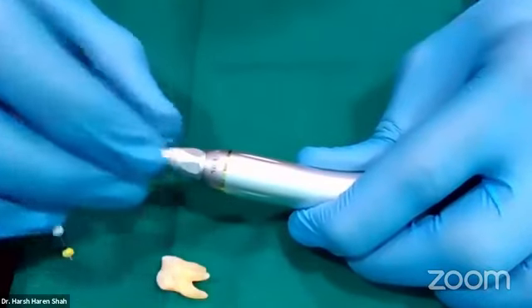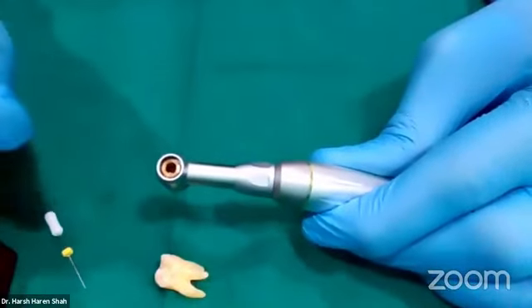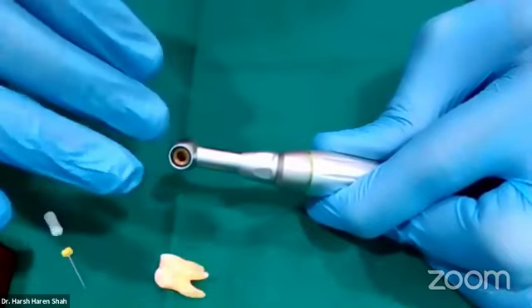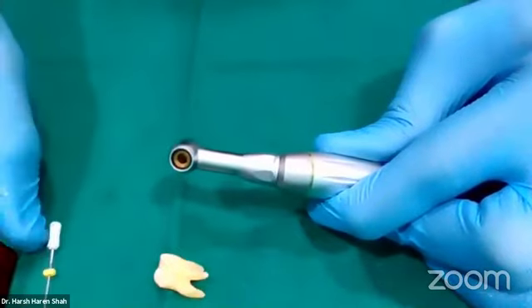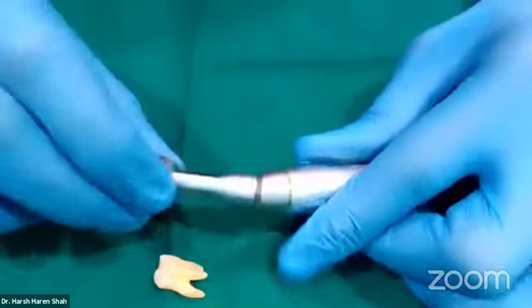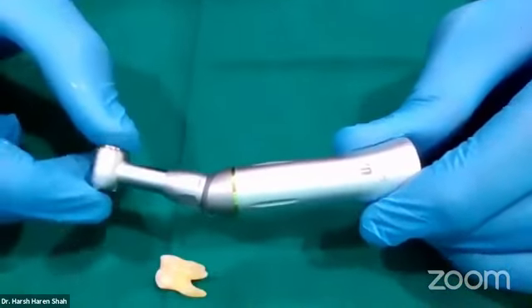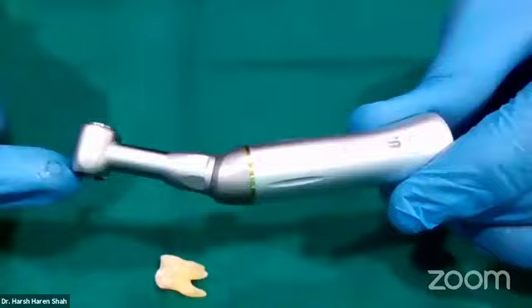The speed at which I'm supposed to do my glide path preparation with this kind of device is roughly around 2000 to 3000 RPM. I know it sounds like a very large speed. It is very fast if you think about it. But because you're using it in a reciprocating motion, there is no iatrogenic damage that we are expecting here. So you can comfortably go to speeds of 2000 to 3000 RPM. Now, to keep a speed of 2000 to 3000 in a 10:1 gear reduction handpiece, you will need to set the micromotor speed at roughly around 25,000. So the eventual final speed on the file will be about 2000 to 3000.